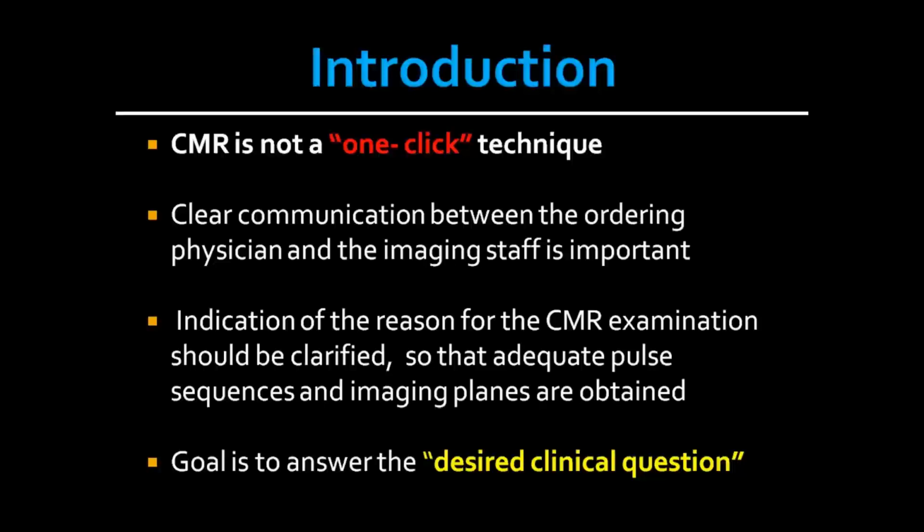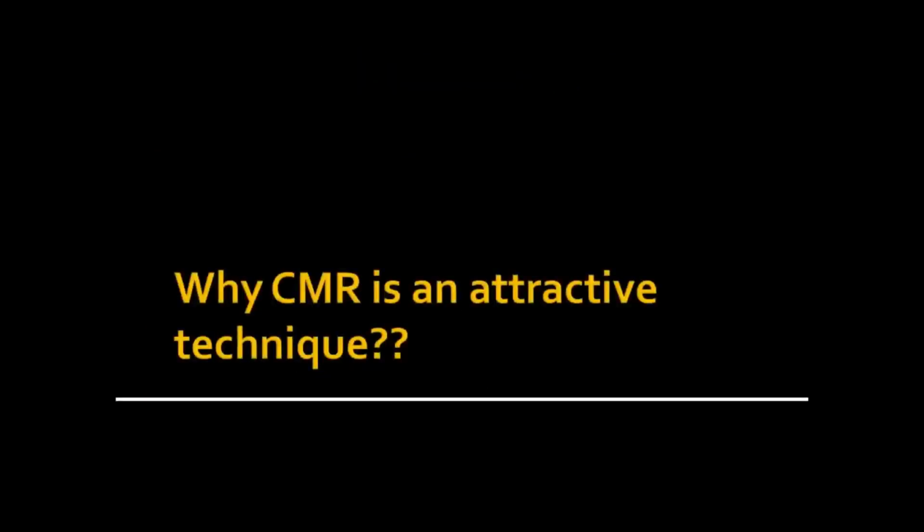What is this mass suggestive of? Is it a benign mass, thrombus, or is it malignant? So there should be a clinical question that you are sending this patient with. So let's answer here this important question: why is CMR an attractive technique?